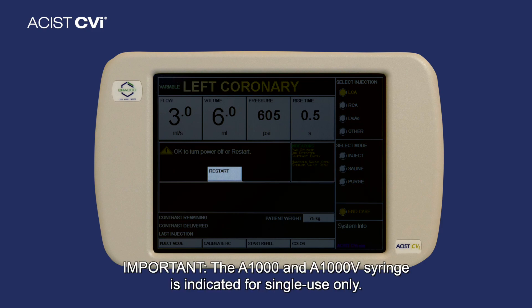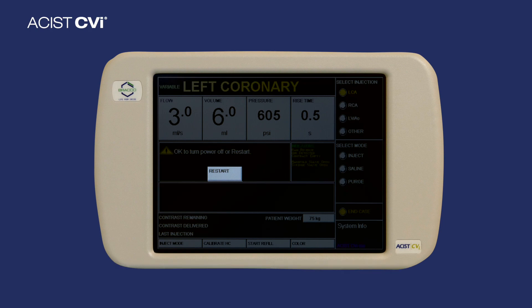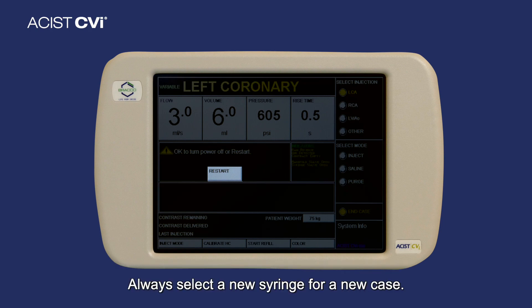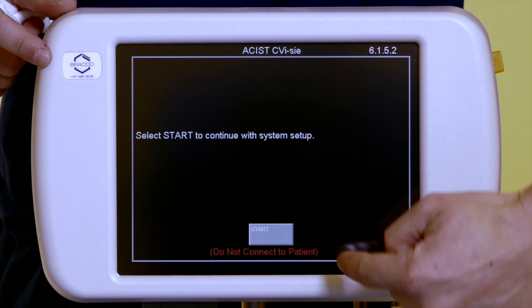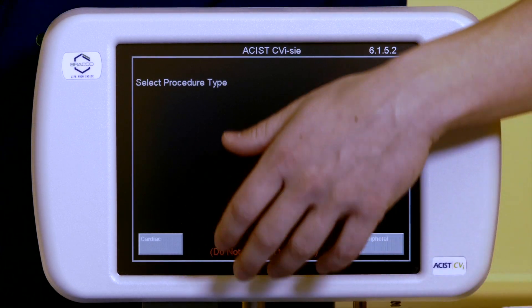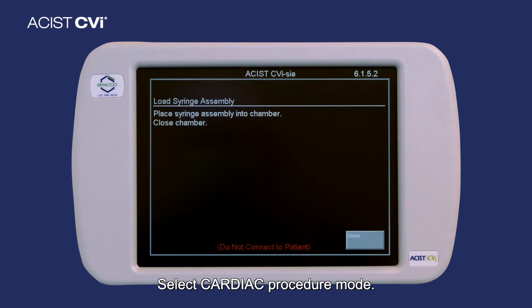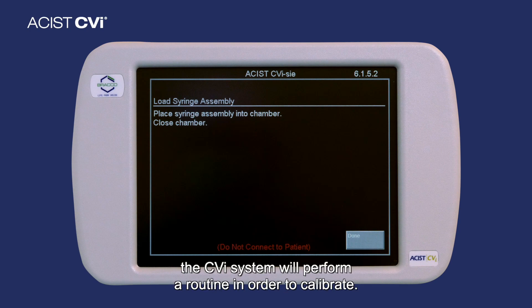The A1000 and A1000V syringe is indicated for single use only. Syringe replacement is required after every case with Persist CVI systems. Always select a new syringe for a new case. Press Start on the control panel and select Cardiac procedure mode. Once the procedure type is selected, the CVI system will perform a routine in order to calibrate.